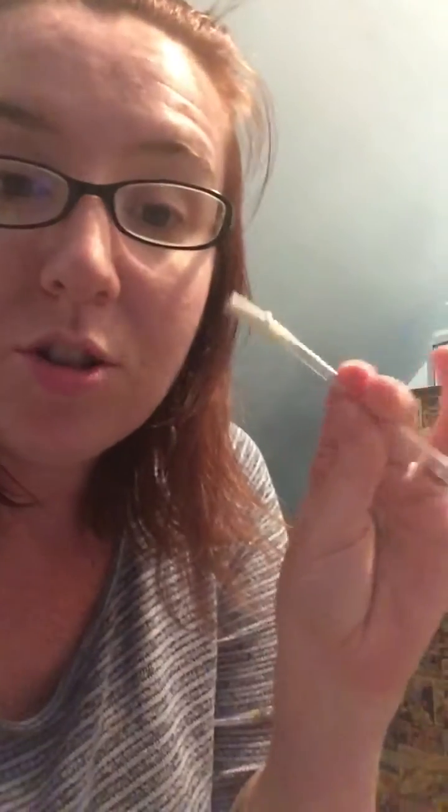The only last thing I suggest that you do is take your tubing out of the back of your pump and turn it back on and just let this run for a second. Because if you do, any condensation that might have built up inside of the tube from the heat while you're pumping from your body, it'll just dry that right out so that water doesn't run down the tube and get into your motor, because that will fry your motor pretty quickly.